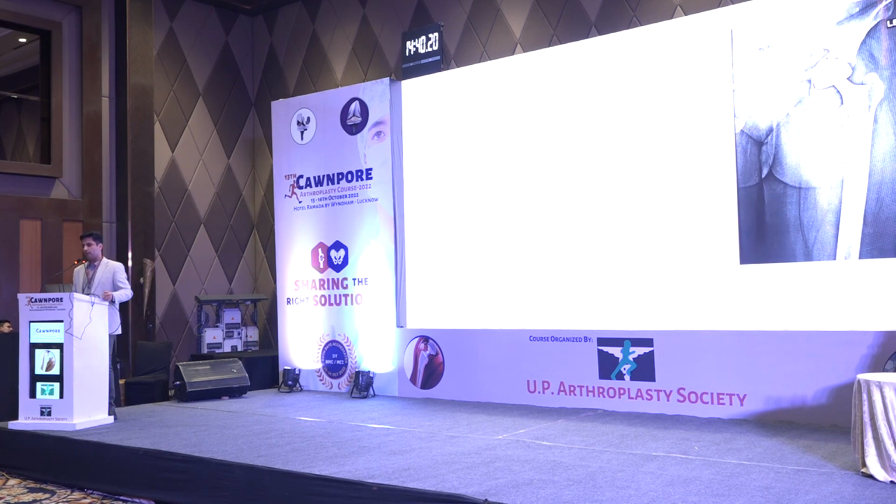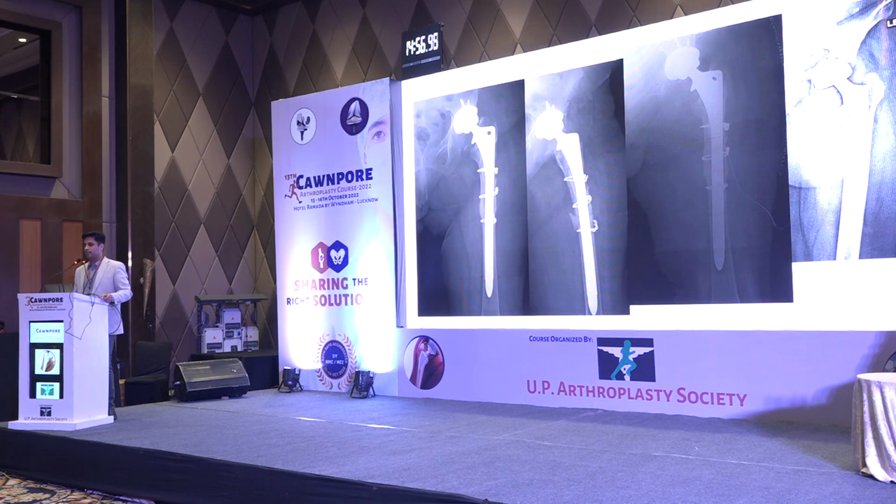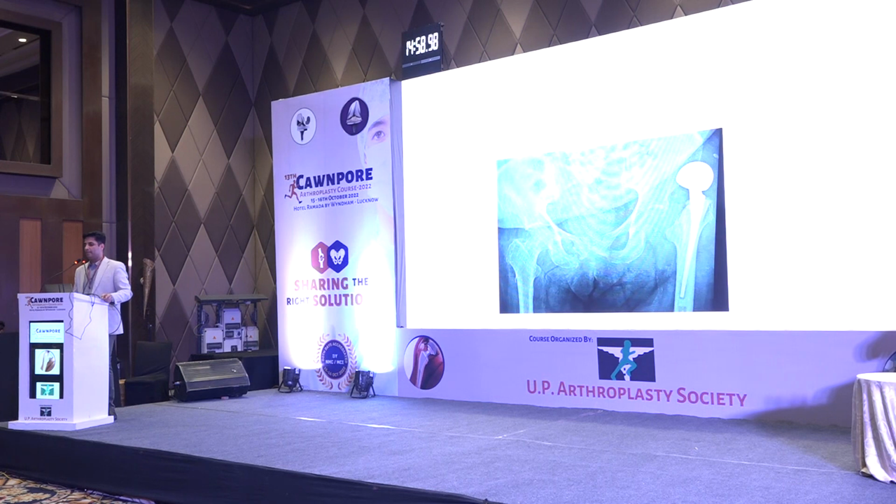That's a patient who fell down and fractured her acetabulum. Now this is a cementless stem with a bipolar cup on it. Again, if you really wanted to, you could go down and do whatever we saw in the video, but we chose to be prudent and we did an extended trochanteric osteotomy for a cementless stem and then revised it on the cup side as well. Sir, it was not possible to dislocate it otherwise.